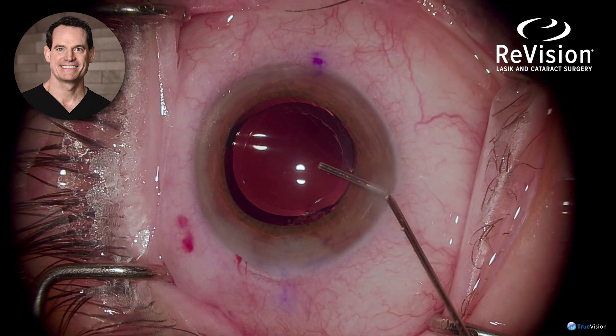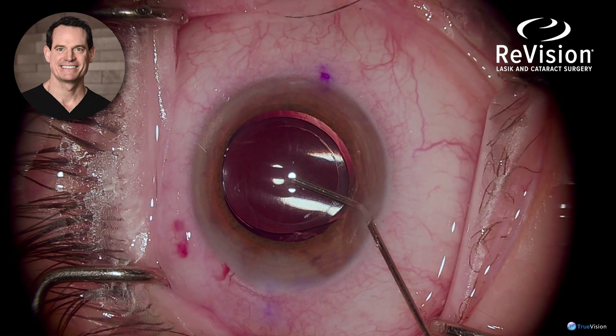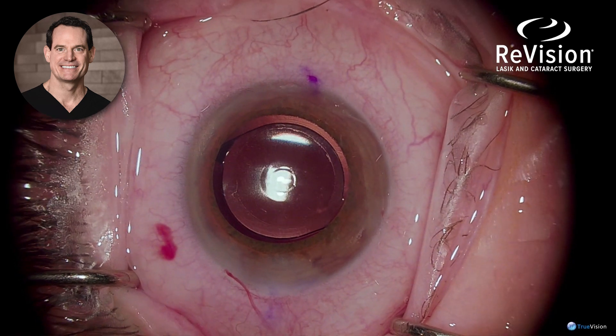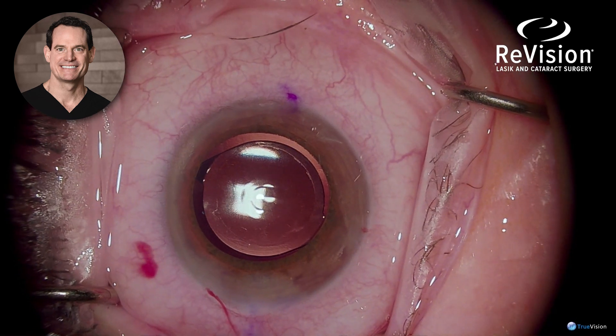Centration of these extended depth of focus lenses is critical, so I always centrate the lens on the corneal light reflex. These lenses perform optimally when perfectly centered.